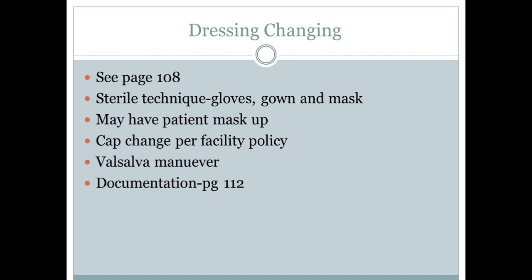So once we put on just regular gloves to remove the old dressing, we're going to look again for any signs of infection, any drainage. If there's any possible questionable drainage, they may want to culture that at the site or off the old dressing. If not, you can discard the dressing and gloves in the bag. Make sure that if there's a lot of drainage, you dispose of it properly according to your facility policy. If you do notice that there is some smell or suspicious drainage, contact the physician for that.